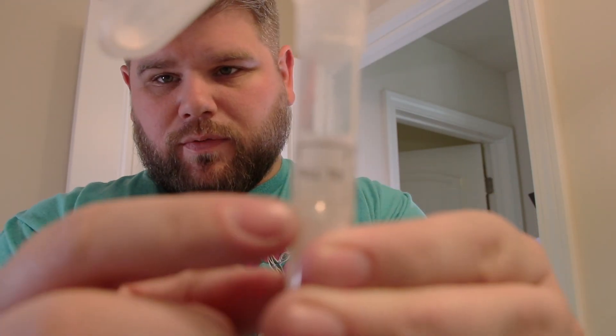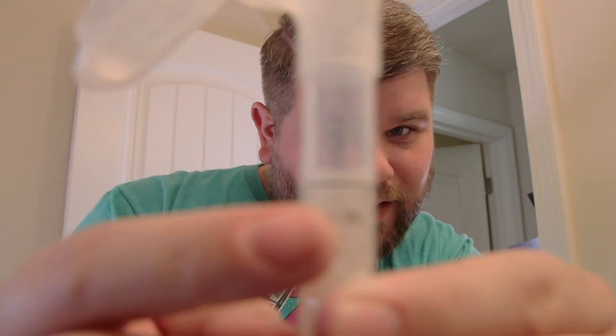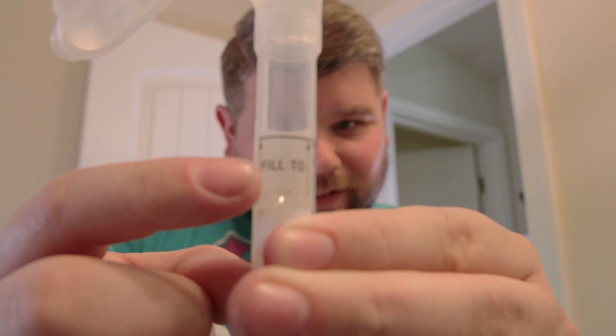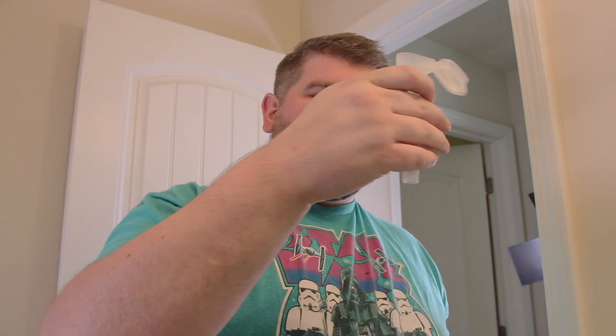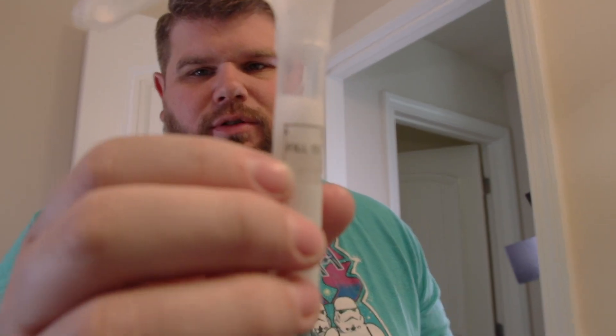The goal is to fill up to that line right there. We got to fill up this container — pretty big container. So they want us to do saliva, and it's going to take some time to get this filled up. I did not realize how much saliva you need. It's not as much as I thought though. I thought it was going to be the whole container but it's just a little piece — a little bit easier than I thought. We're almost there. I think that's actually good.